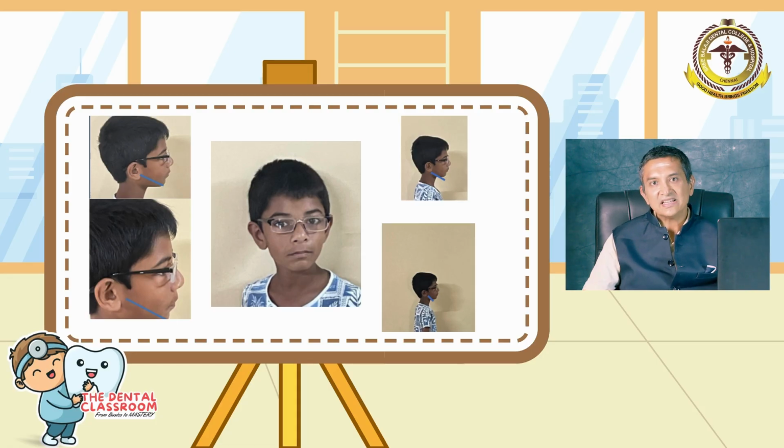This is completely eliminated in a lateral cephalogram because all over the world the distance is standardized to 5 feet, and therefore all these parameters will eliminate the scope of magnification. At a postgraduate level, we have to understand that there will be machine to machine variation, and this is given a leeway of 5 to 7% to a maximum of 10%, as the literature shows us. The take home point from this slide is that a natural lateral view of the skull is different from a lateral cephalogram, and I hope I have made the point loud and clear.